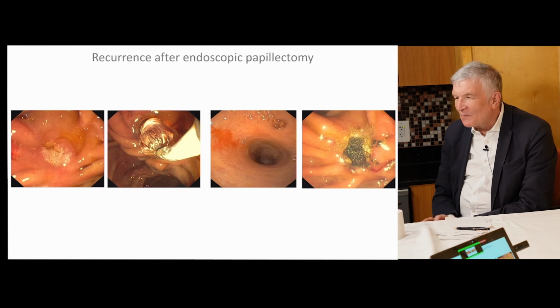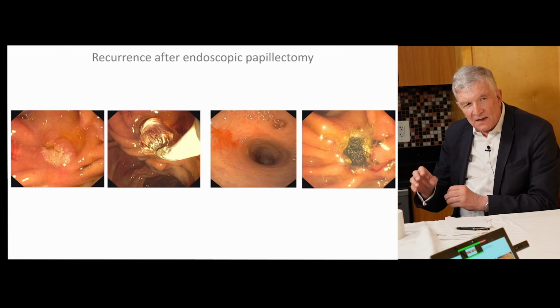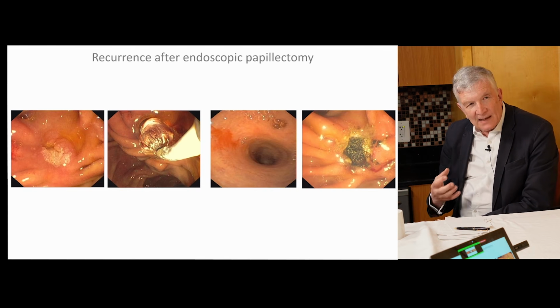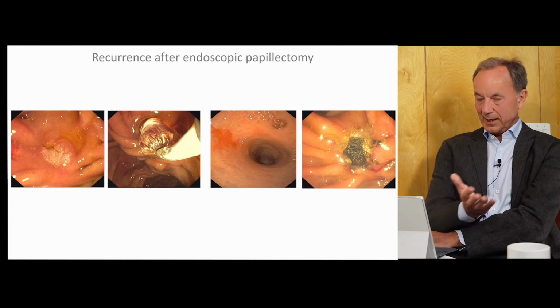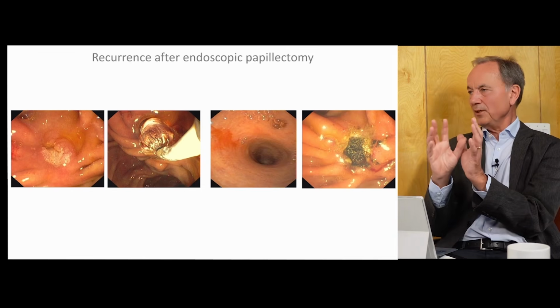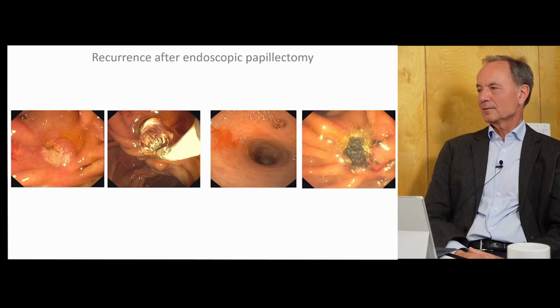Yeah, that's true. But I also agree with you that you should be moderately aggressive, placing stents, and then you can ablate the distal bile duct, maybe aggressively, and then place a metal stent. So you have the compression effect, etc. The compression effect, and when patients come for the next follow-up, you have a nice view into the CBD and can easily manipulate.